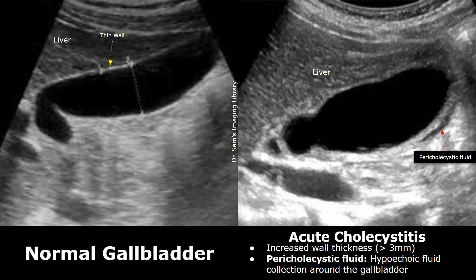Here's another case of acute cholecystitis. This is also without gallstones. You can see an increased wall thickness, measuring greater than 3 mm. You can also notice a hypoechoic area outside the gallbladder wall. This is the pericholecystic fluid, which is also a feature of acute cholecystitis.